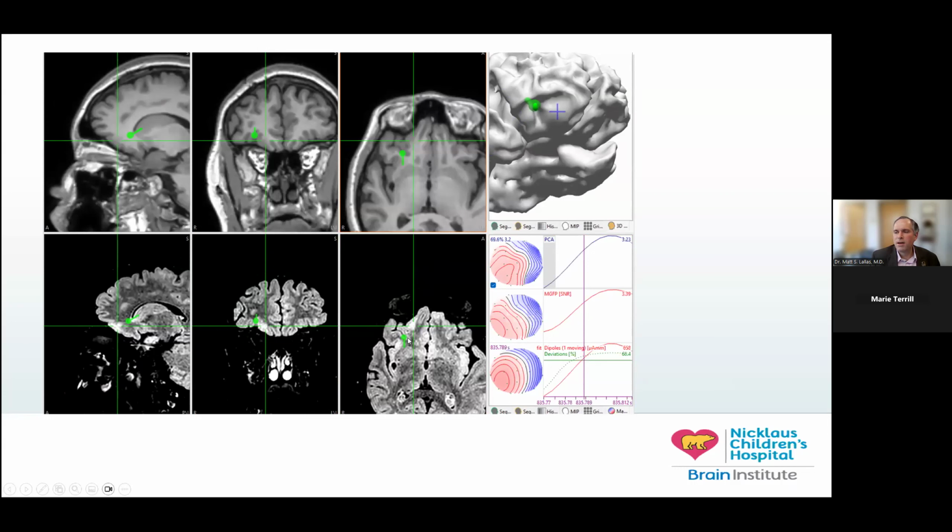So these two cases illustrate some of what I've talked about, how the ESI can help us with cases where the MRI is negative, although again, that first case wasn't actually MRI negative when we got our epilepsy surgery protocoled MRI done appropriately, but on the initial outside one, it hadn't been shown. Also in the case where we have multiple malformations and we want to try and pin down between them. What are the other ways that we can think about how beneficial this is, contributing to pediatric epilepsy surgery evaluations?